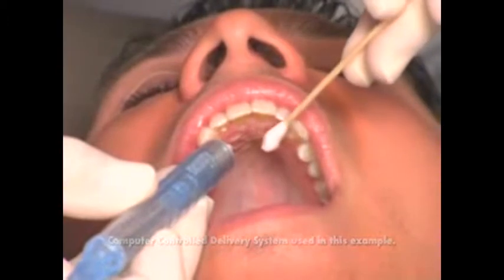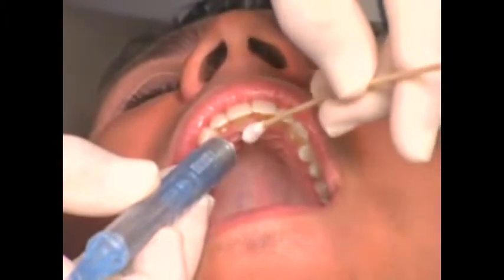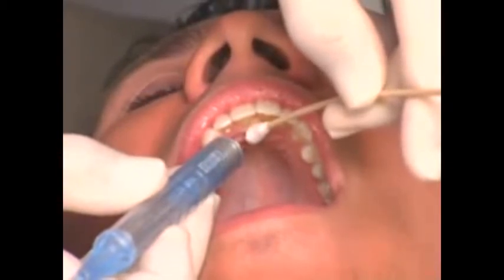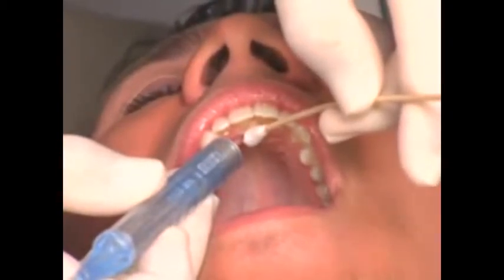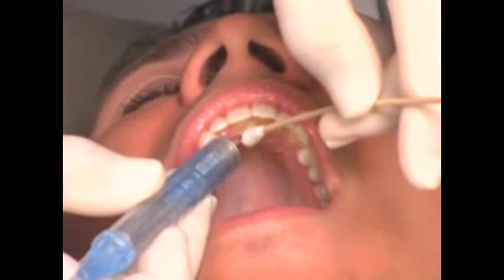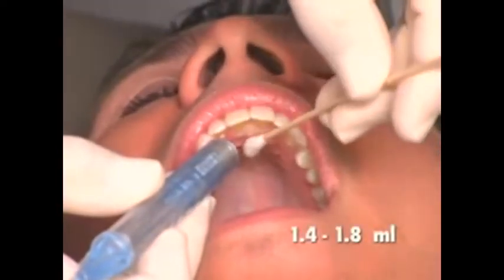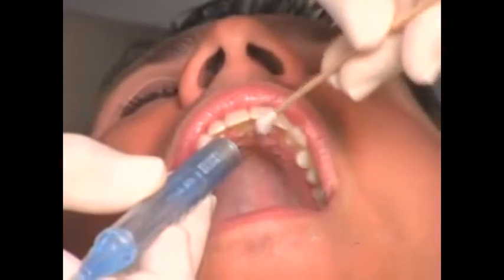The needle is inserted into tissue lateral to the incisive papilla. The needle is inserted slowly to a depth of 6 to 10 millimeters into the incisive canal. Following negative aspiration, a volume of 1.4 to 1.8 mLs of local anesthetic is administered slowly.